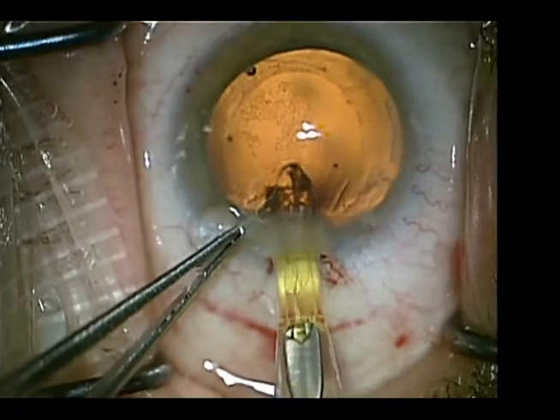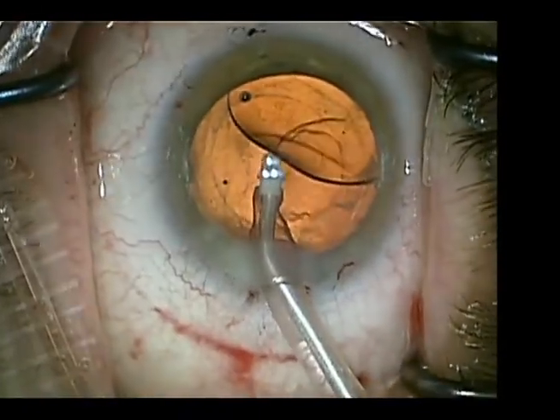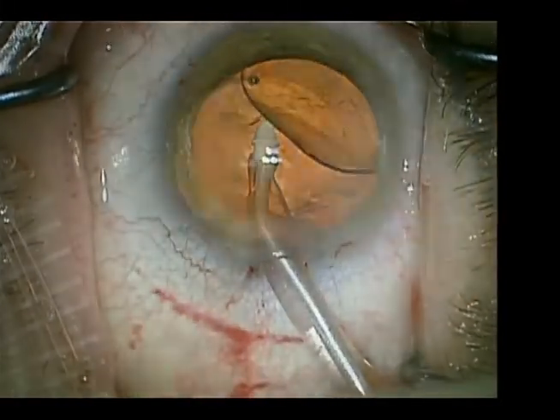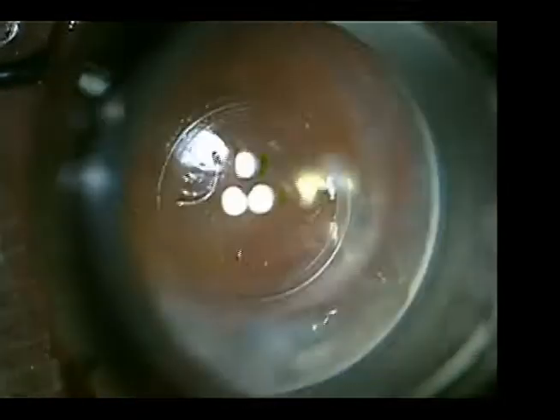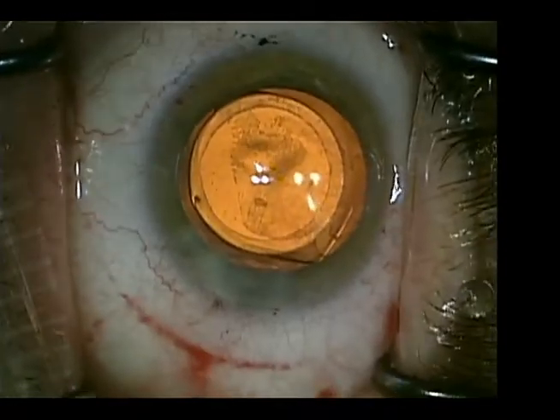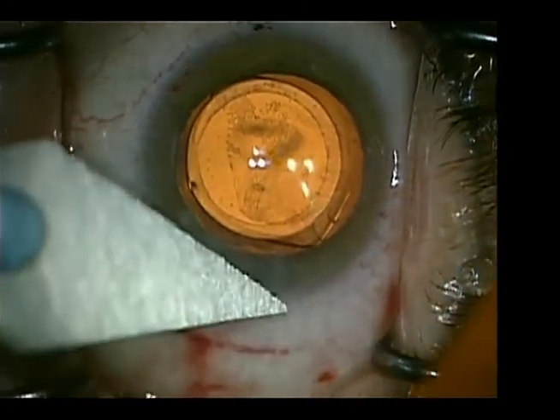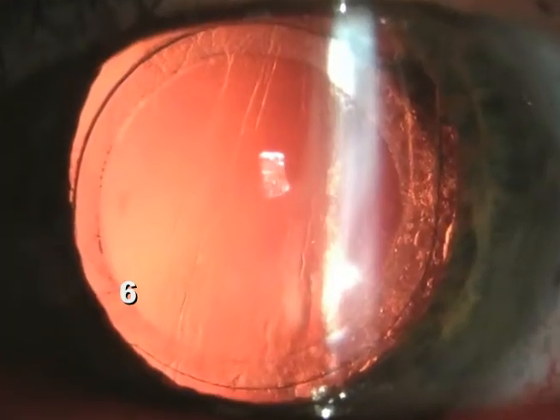Following this, an appropriately powered single-piece acrylic monofocal lens is then implanted into the capsule bag, and the visco agent is removed from above and below the lens, intraocular pressure set at physiologic levels, and the incision then tested with fluorescent dye in the manner of a Seidel test.